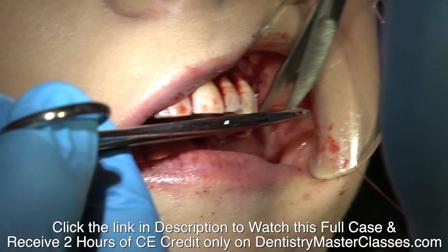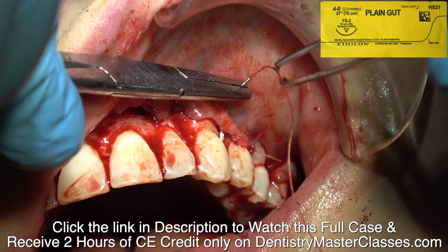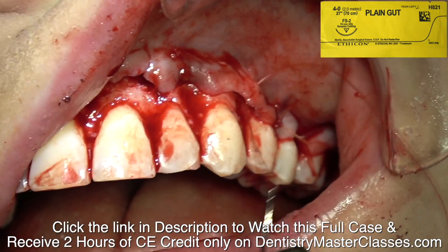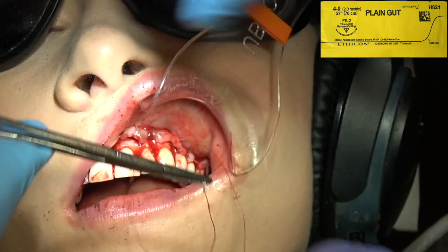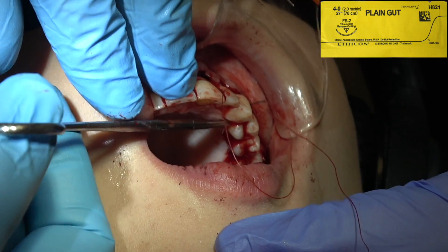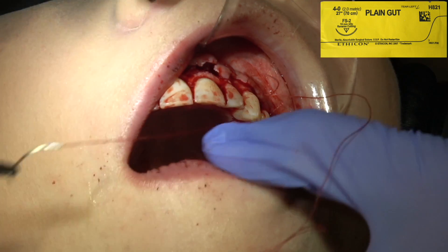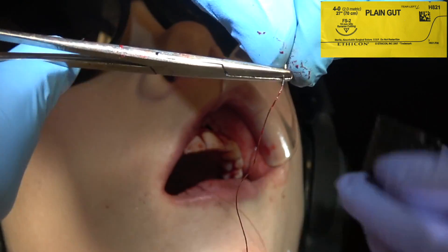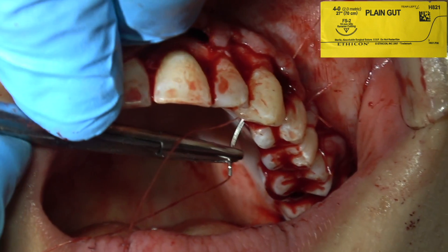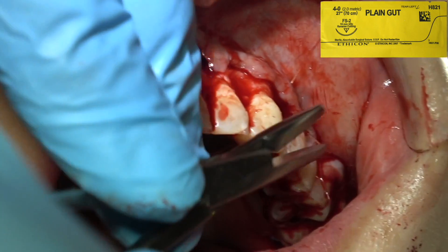I've not found a fast way to suture — just take some time. We're going through the flap, then I'm going to move the needle through the interproximal area to the palatal side. I'm not trying to engage the tissue on the palate. Now I'm going to engage the palatal tissue when I come back through, and this is where we anchor the flap on the palatal tissue.